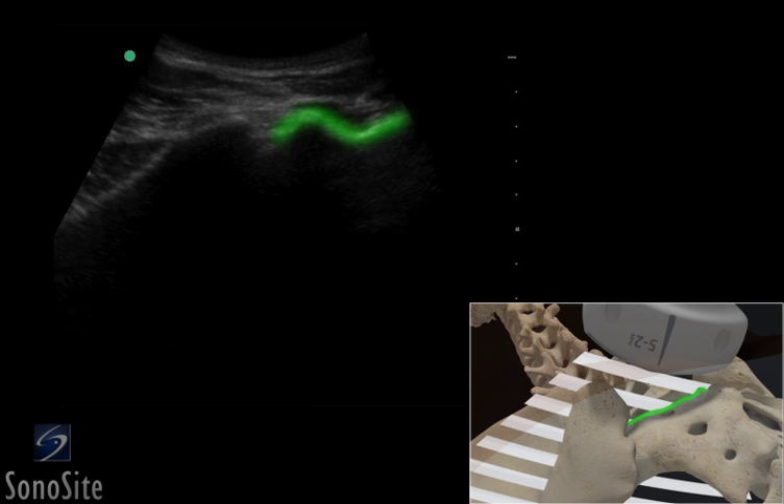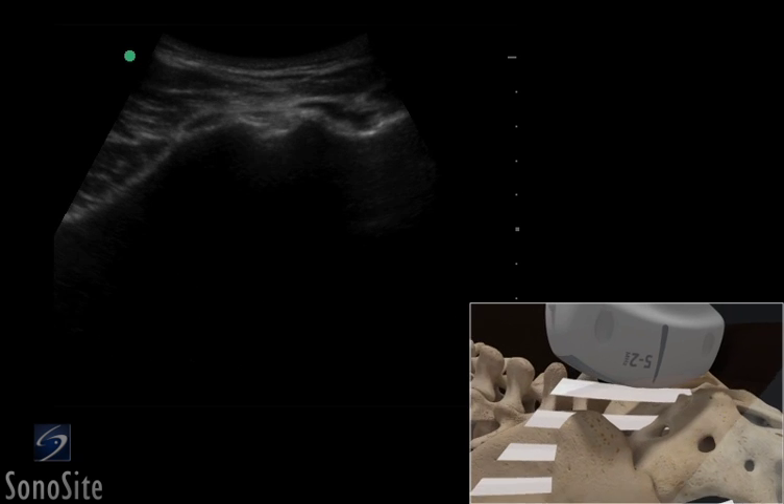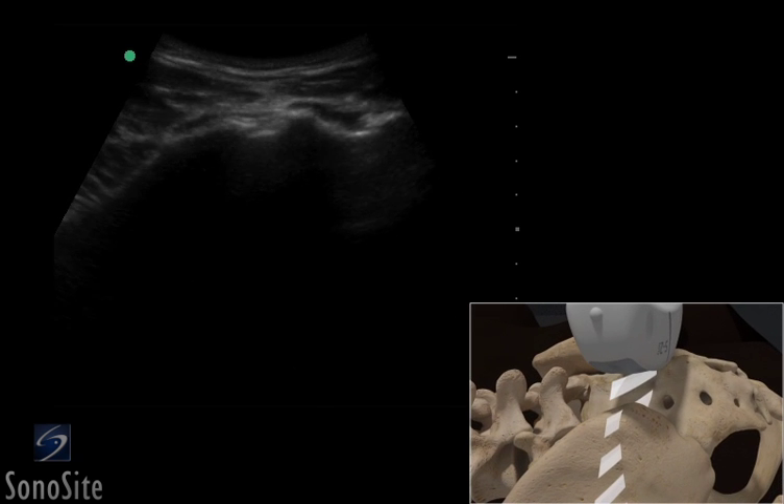The angled junction of the sacrum and the ilium defines the needle entry point to approach the sacroiliac joint. Care should be exercised to avoid the S1 and S2 sacral foramina, which are close to this position.